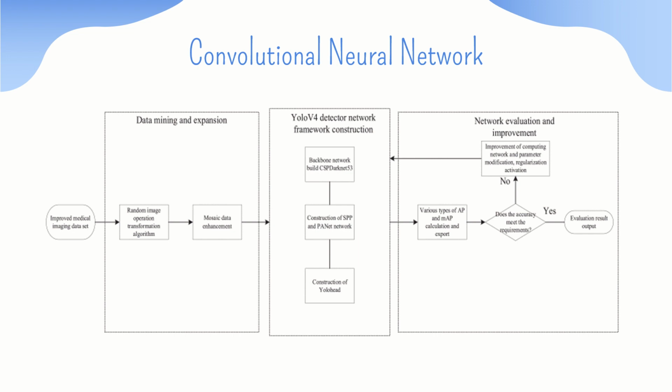Here, a backbone network is used, which is a deep neural network. It is used as a feature extractor for various computer vision tasks. As the term suggests, backbone means this network serves as a foundational structure upon which additional layers and modules are added to achieve the desired goal. CSP Darknet is a backbone network. The full form of CSP is cross-stage partial network, and Darknet 53 is a popular network used in YOLO V4 object detection system.